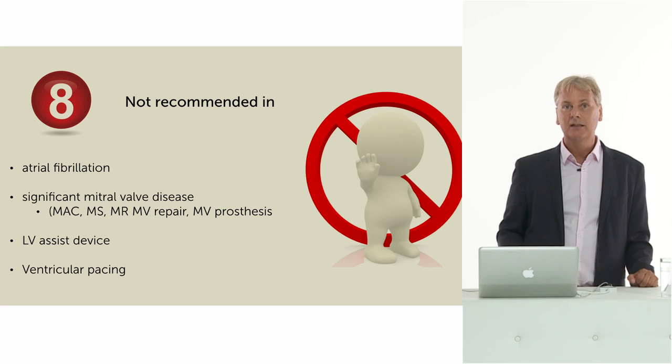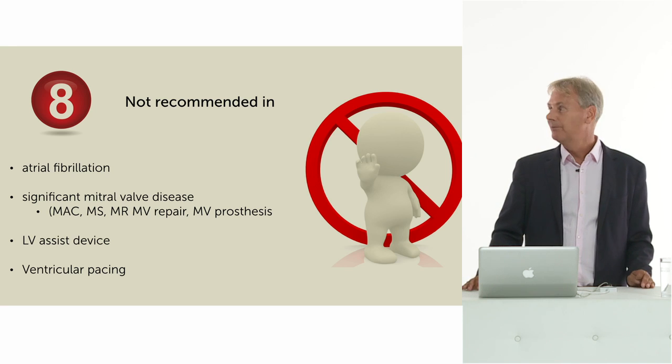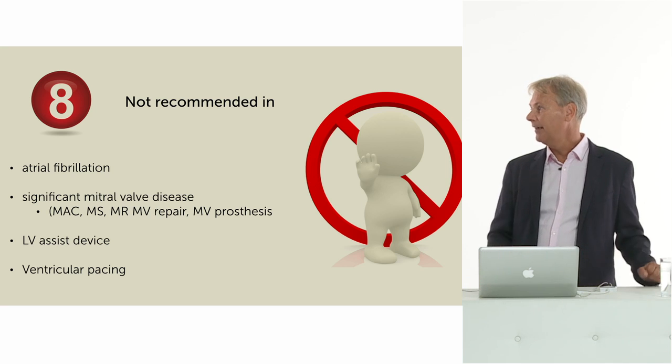However, you have to be cautious because it is not recommended in atrial fibrillation, in significant mitral valve disease. What is MAC? It's the calcification of the mitral annulus, the mitral annulus calcification, and we have to say that from moderate mitral annulus calcification on, there are also no data for measurement of E prime.